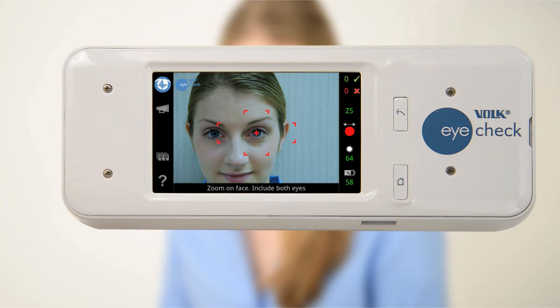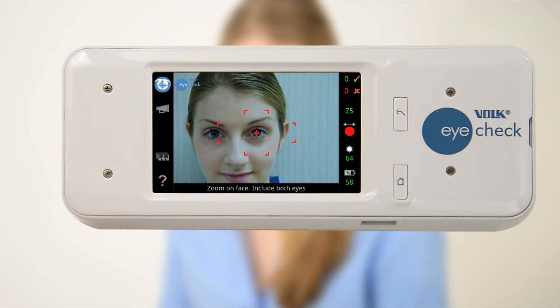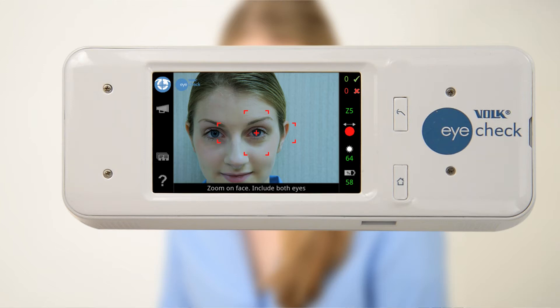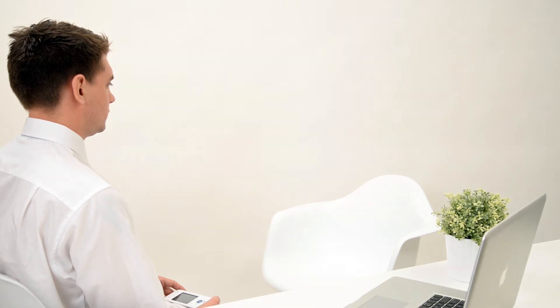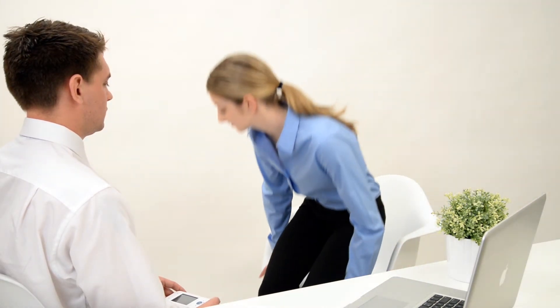Make the necessary adjustments for proper measurement sessions. Ensure that the patient is sitting or standing comfortably in front of a neutral background. Avoid backgrounds with large windows, mirrors, and strong reflections.